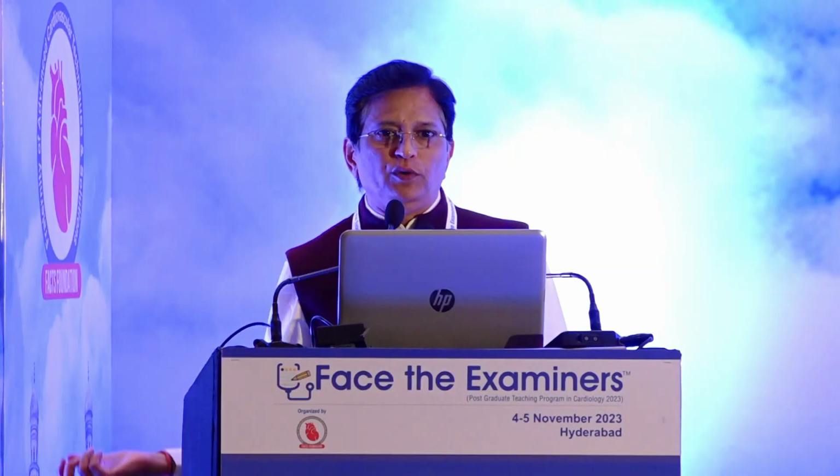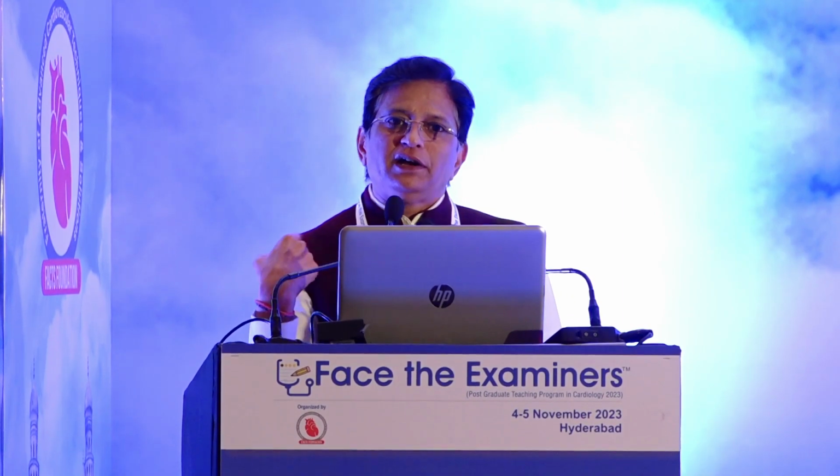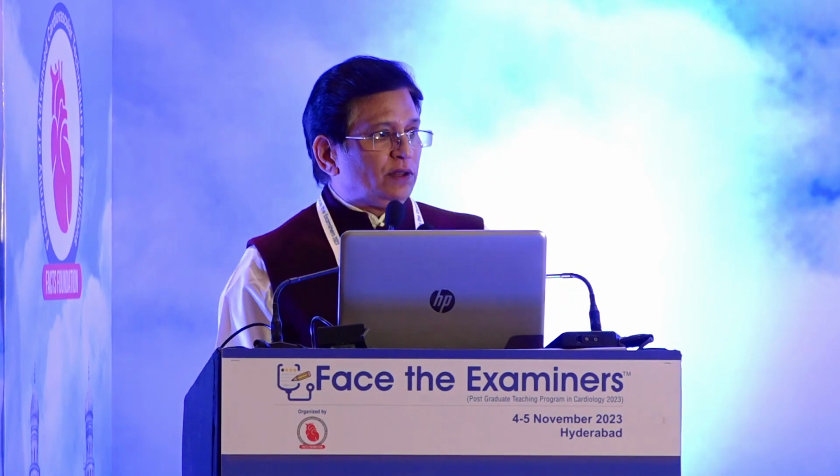But the problem is, when the patient's BP is 30, 40, you really can't do all those things. At that moment, when the stent was already gone, because I did a POBA initially, it gave me just 5-7 minutes of time. Going there and doing a puncture with the radial artery, left side or right side, by the time I cannulate, I lose the patient. So I had no other option but to go ahead with that. Okay, thank you so much.